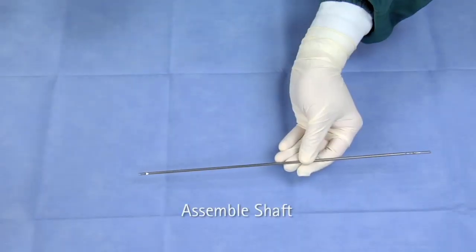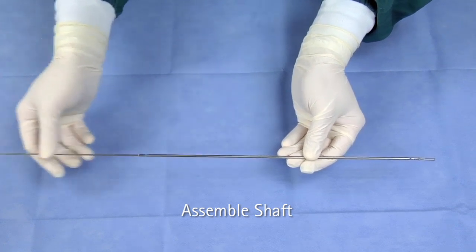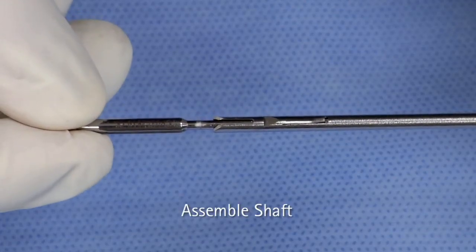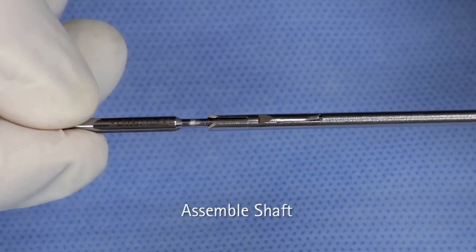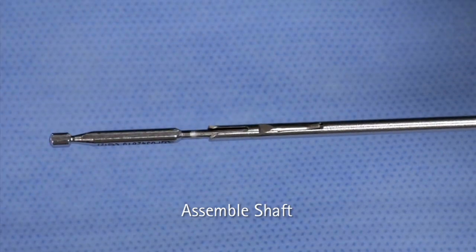To assemble the Sovereign Mini laparoscopic instruments, slide the push rod into the jaw insert as far as it will go, making sure that the labeling on the push rod is in line with the notch of the jaw insert. Rotate the push rod 90 degrees clockwise until it locks into place. The groove is then in line with the notch.